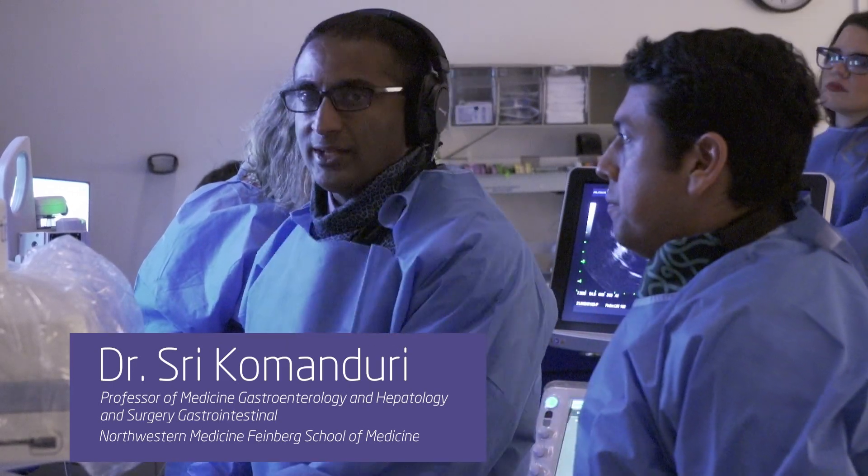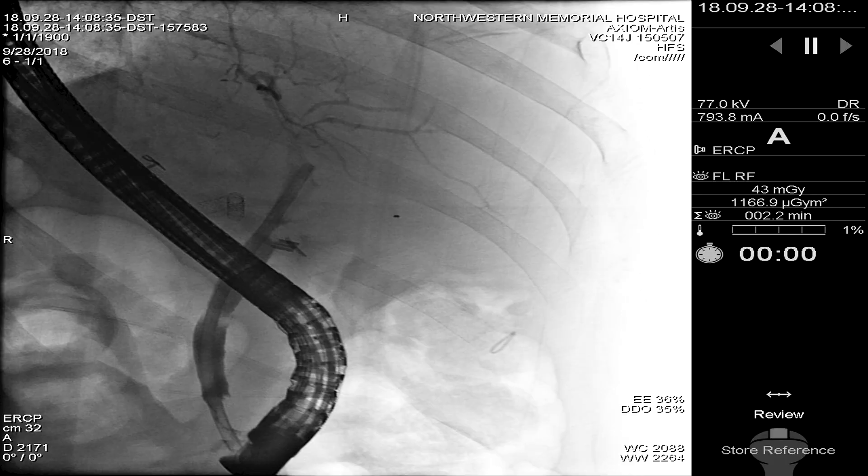Can we put fluoro up on the center screen for a second, just so you can see the final? We pulled the sutures out — we got all the suture out. We went ahead and placed a plastic stent. I think that suture is not as functional as we think, but the sutures coming out may help. For the edema, we went ahead and placed a single plastic stent this time. We're not concerned about this needing long-term multiple stents with the sutures coming out, because she's not jaundiced.